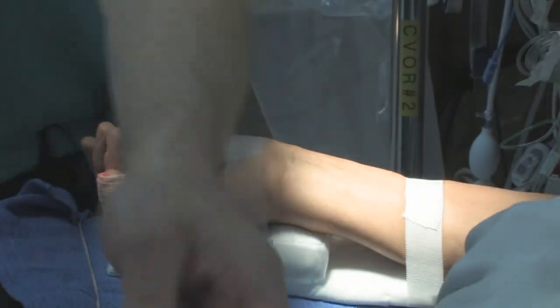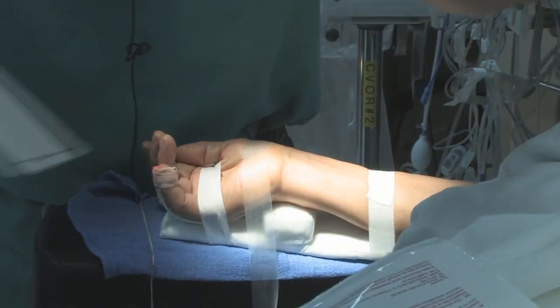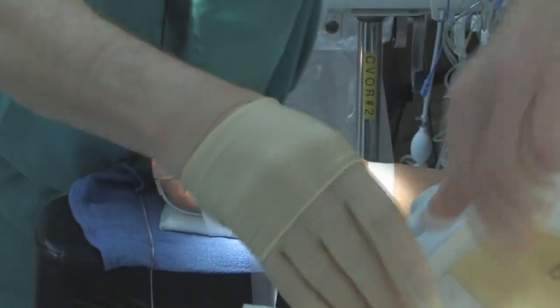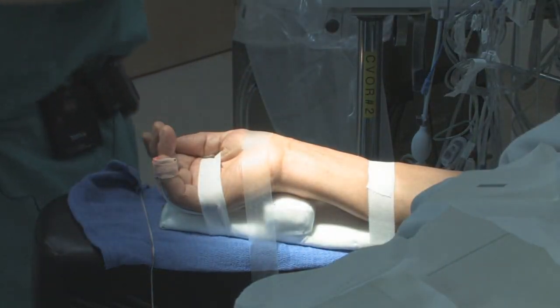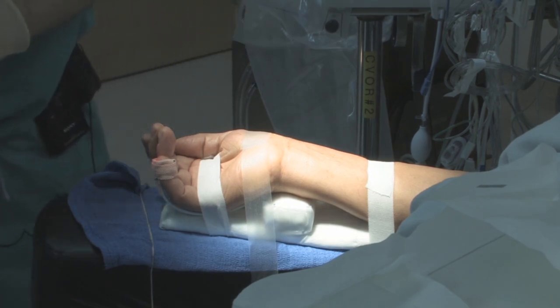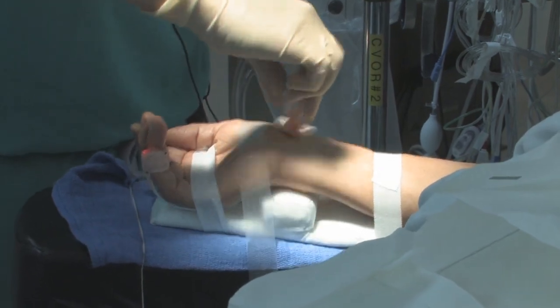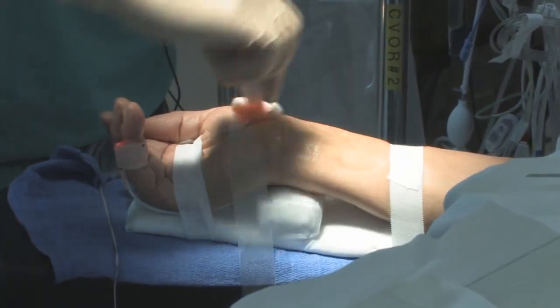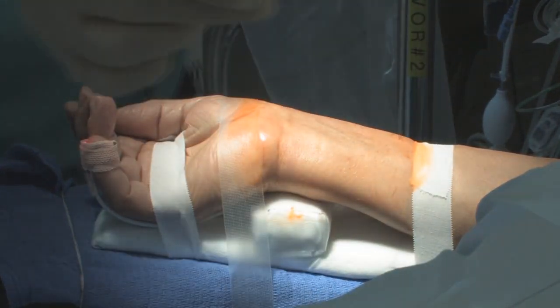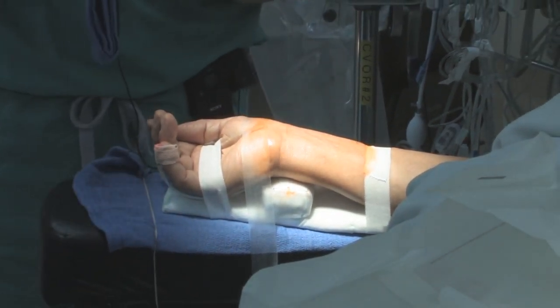Now we prep — we're not scrubbing, we're putting it in sterilely. We put on sterile gloves and have the kit prepared. Like any surgical field, we have a prep stick — kind of like a shoe polish applicator. You start in the middle and work your way around, going wider and wider. You never come back in; you go side to side.